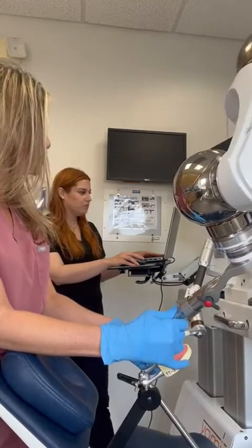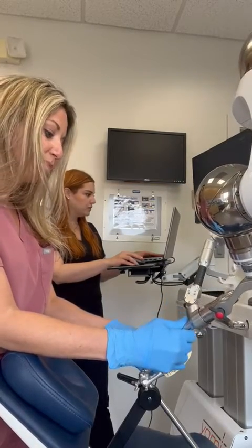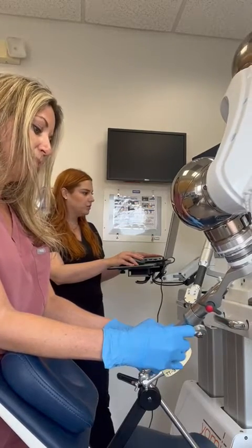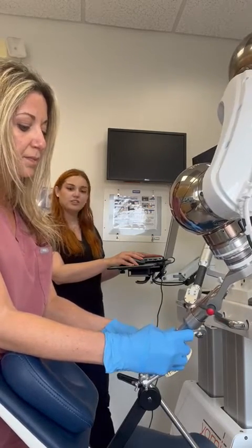So we're going to go ahead and get it to position. All right, so you're going to go up towards the nose — keep going. All right, and you're locked on ready to drill. So now we're locked on and ready to drill.